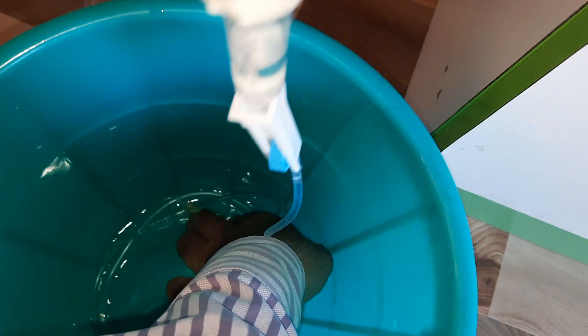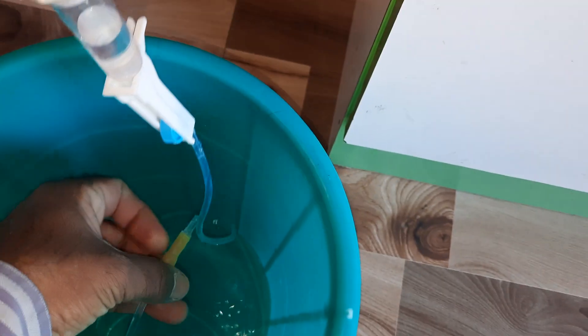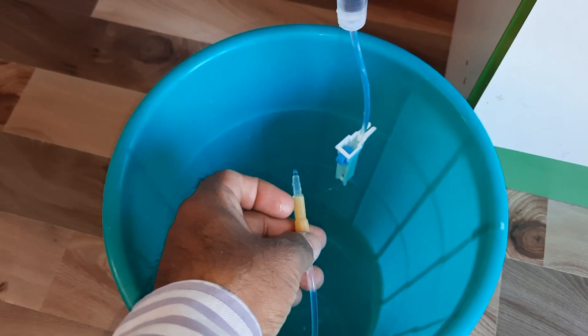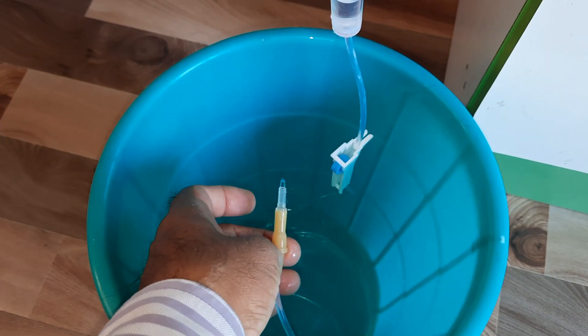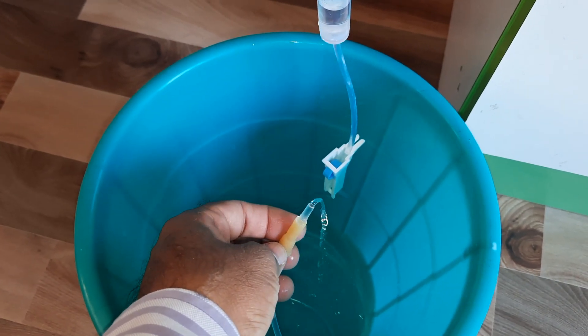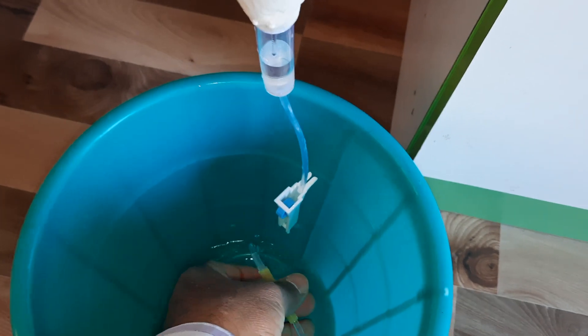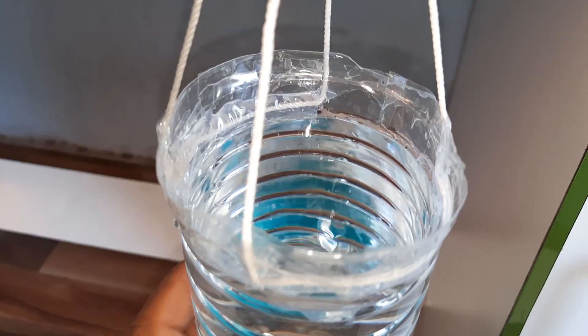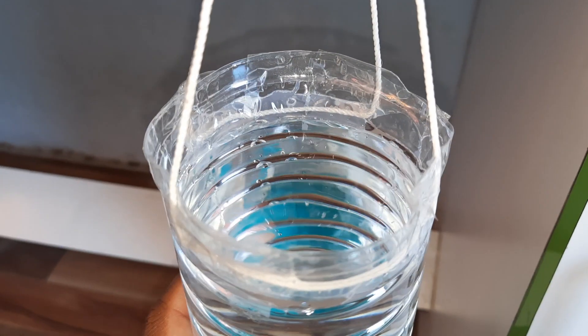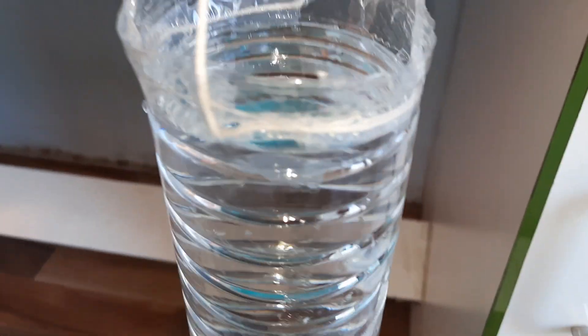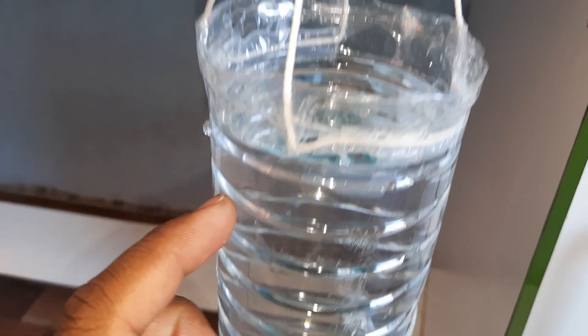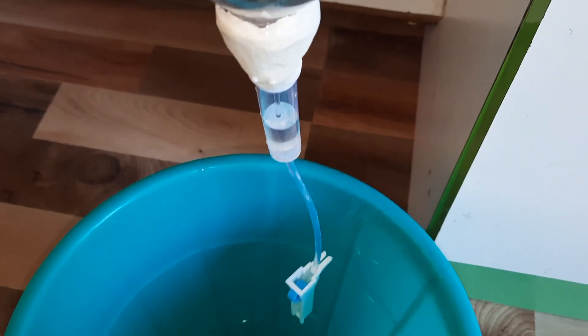Now the saline bottle is draining, so the weight goes on decreasing. When it reaches the low level, we will get the SMS alert.